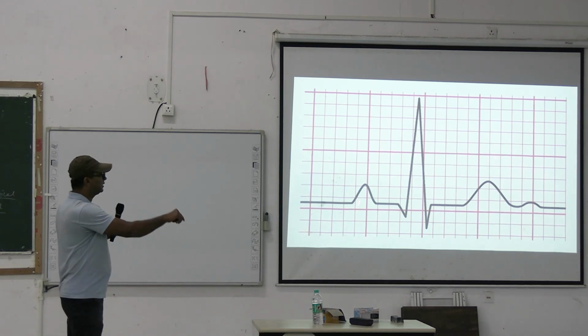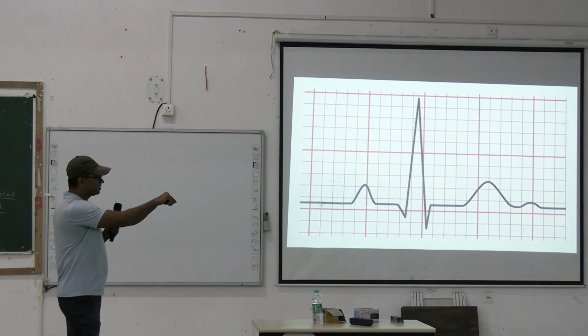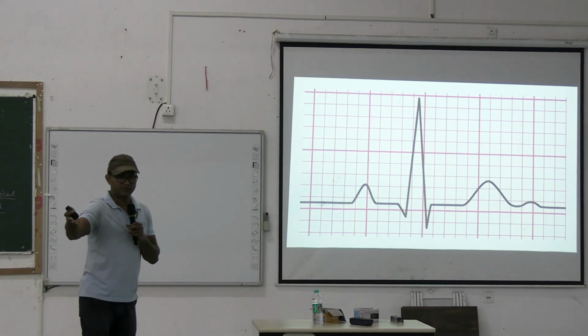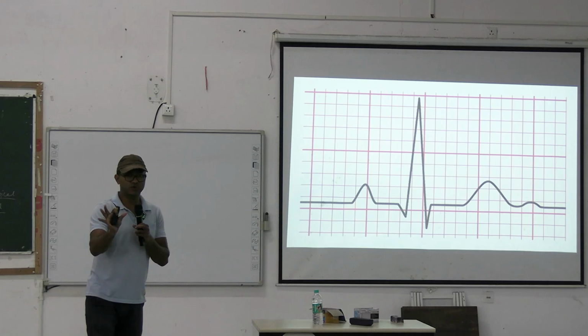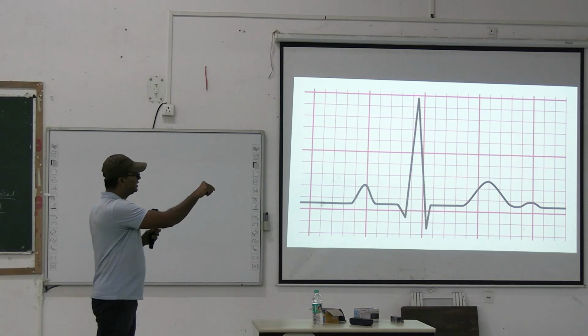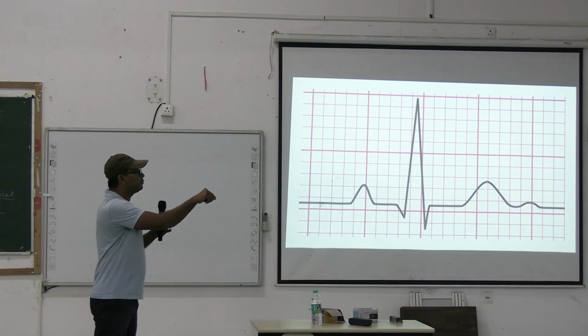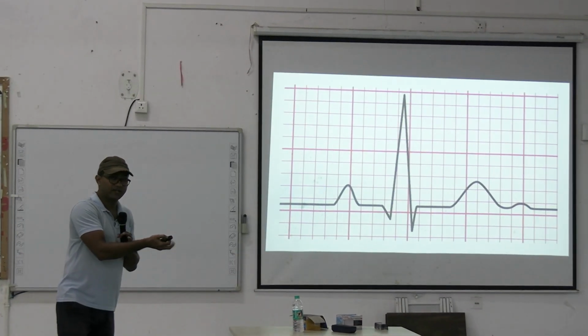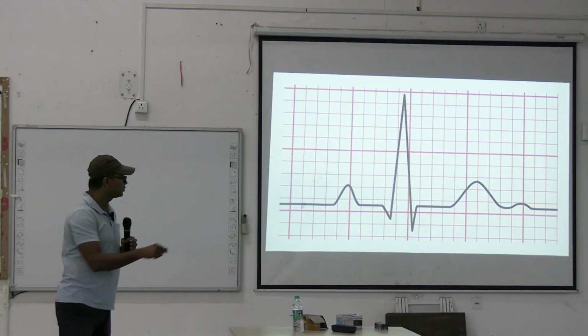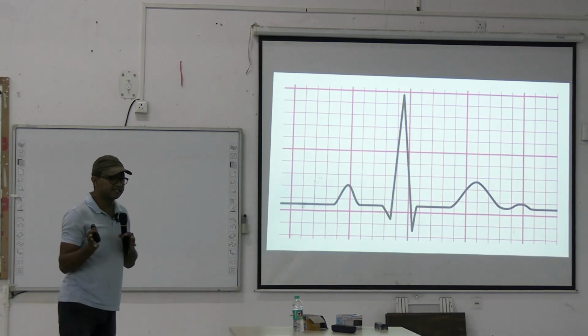Eta to is your atria is depolarized, tarpore ventricle depolarized hobe, but in between there is no net electricity flow, right? In between there is a gap. Okay, but eita ventricle depolarized hoye geche, now repolarize hobe. Okay, T wave is repolarization, right? So during this time there is no net electricity flow. Why?